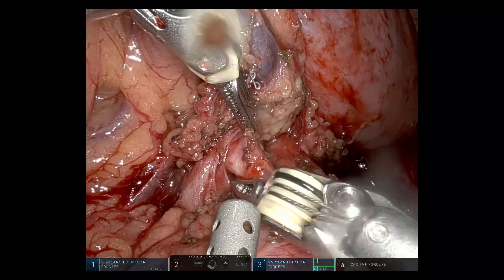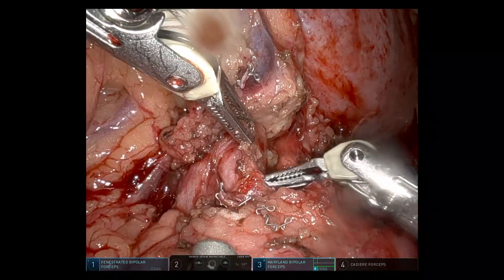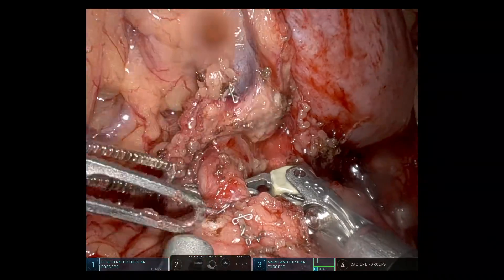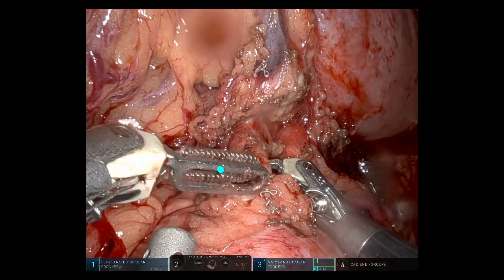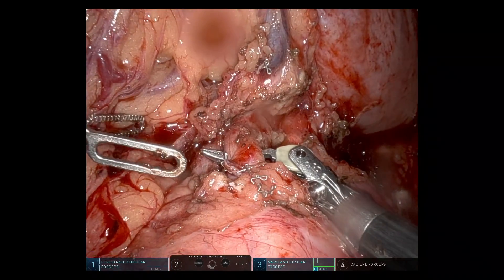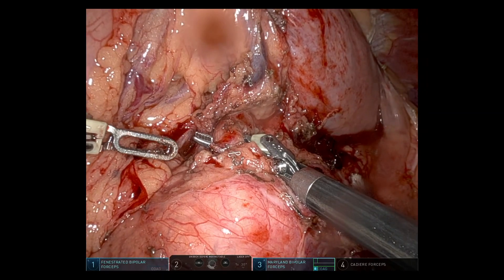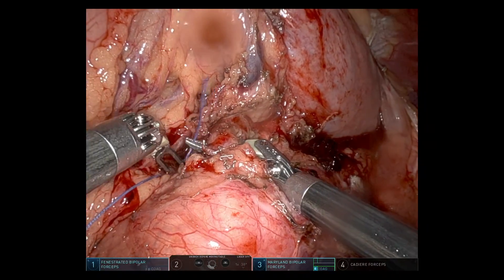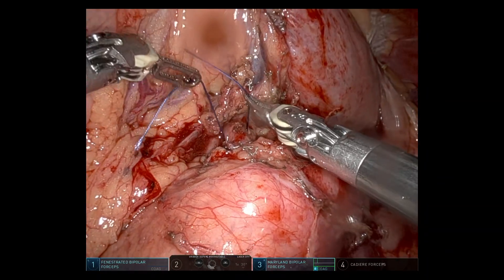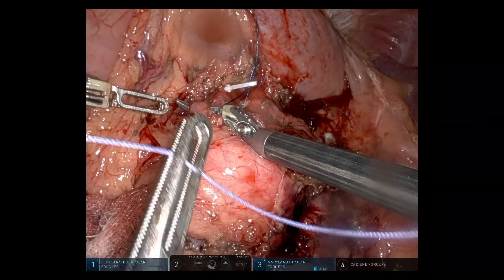Dissecting out the splenic artery with an additional superior pancreatic branch just to the left. Going around these vessels with a Vicryl tie so I can tent them up to get the stapler underneath them. These vessels were dealt with using a combination of the 30mm stapler and the Hemolock clip.